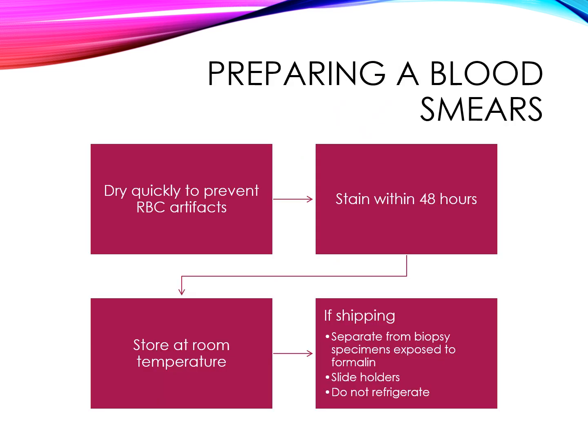Once you have made your blood smear, it should be allowed to dry pretty quickly by standing it up against something usually, or in a slide drying rack, and then we stain them. So you want to make sure that the slide is completely dry before staining it, and then we'll talk more about the staining procedure in a little while. All slides should be labeled with the patient's name and the date or ID number that is in their chart, and they should be stained within several hours. Any lapse longer than 48 hours may result in inadequate staining.